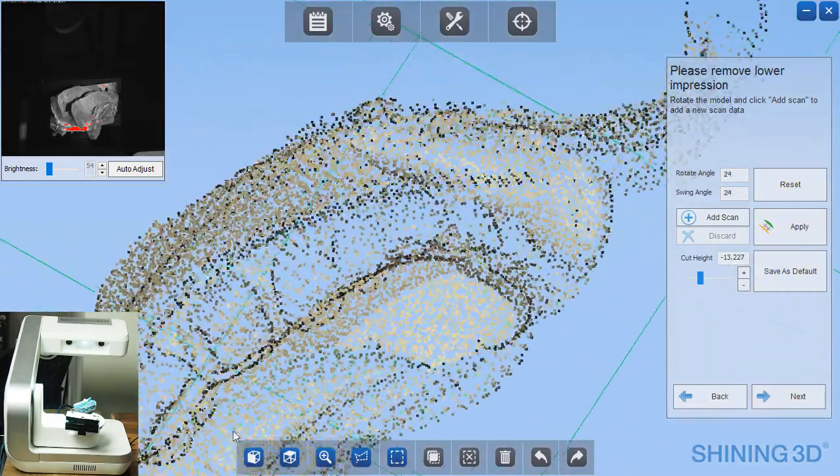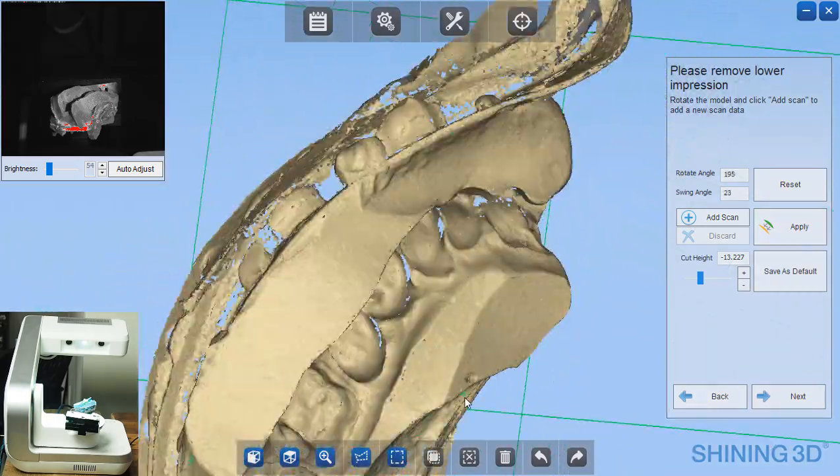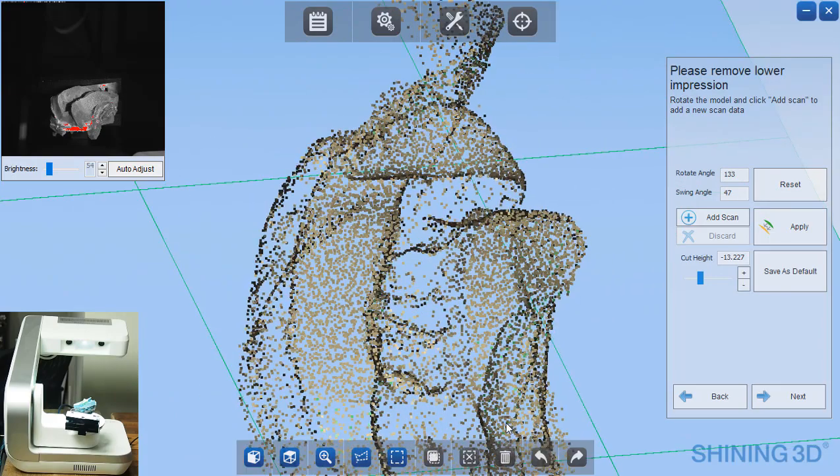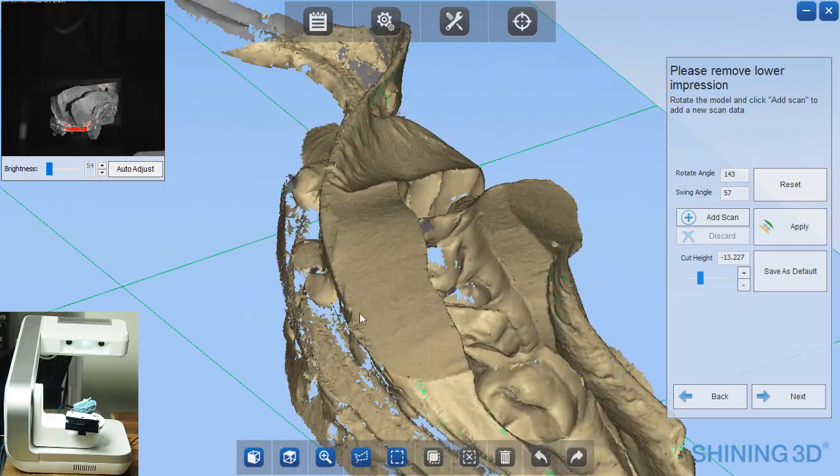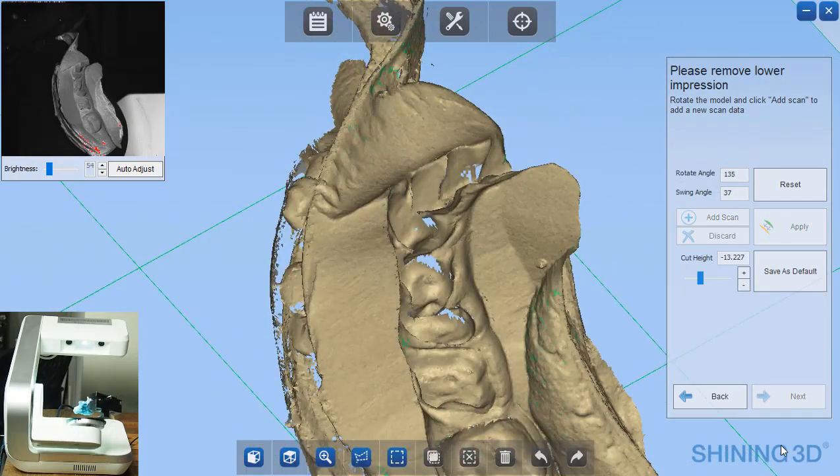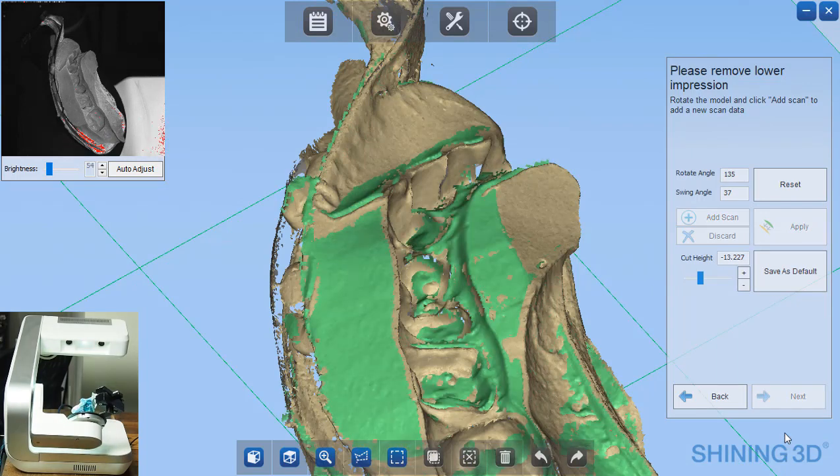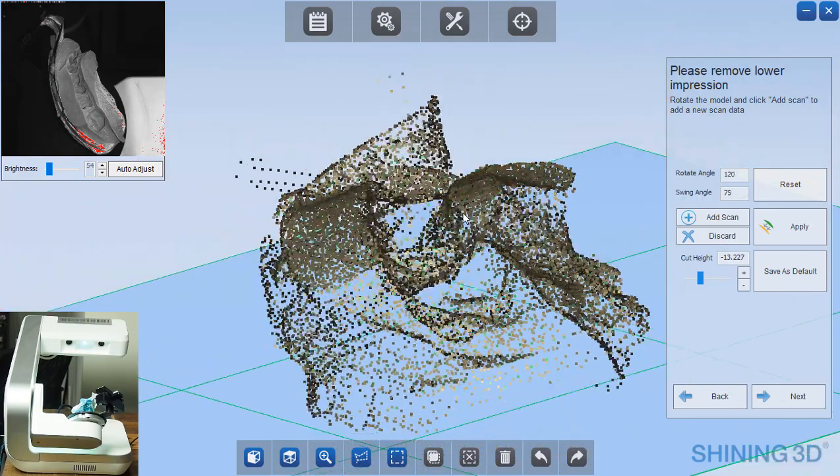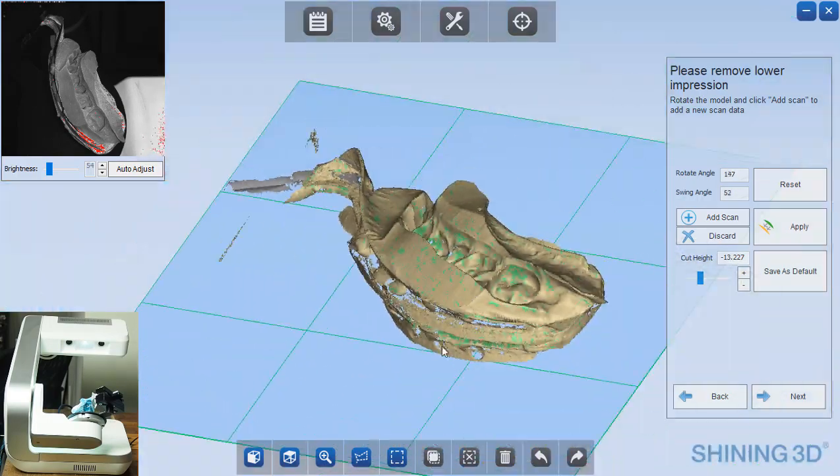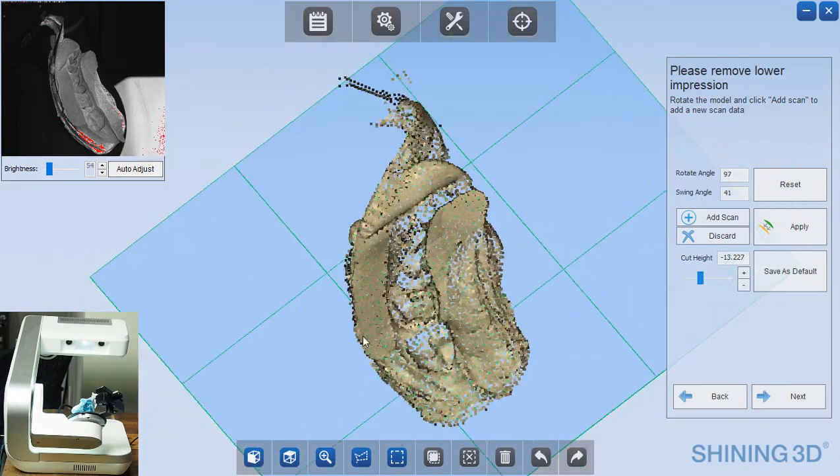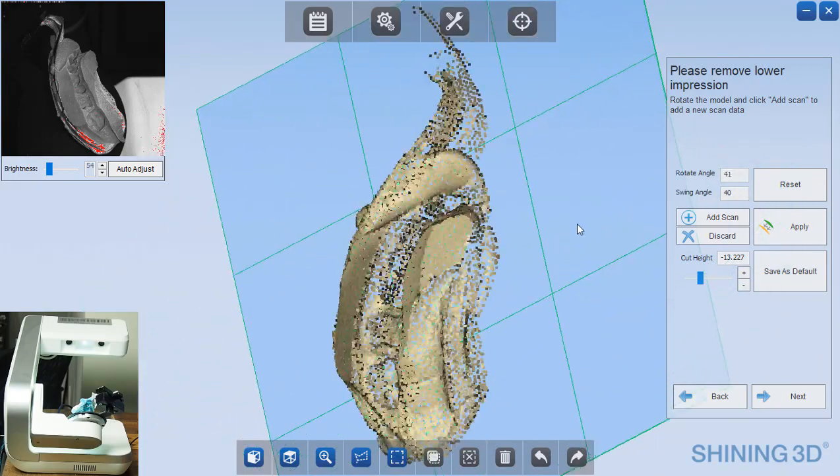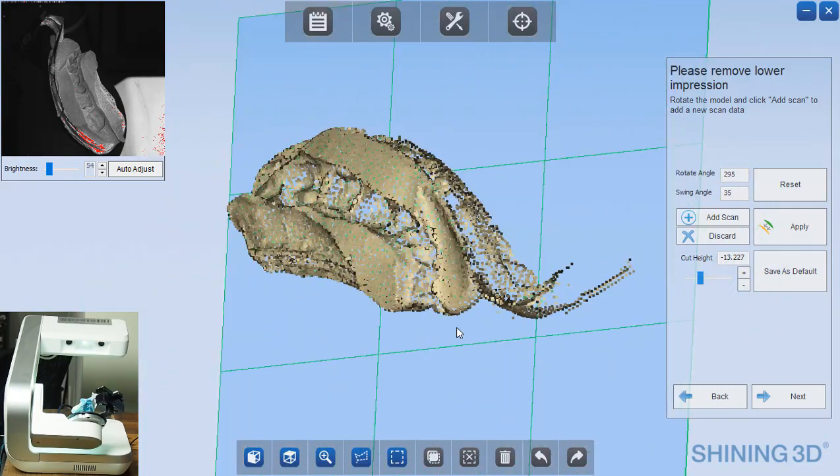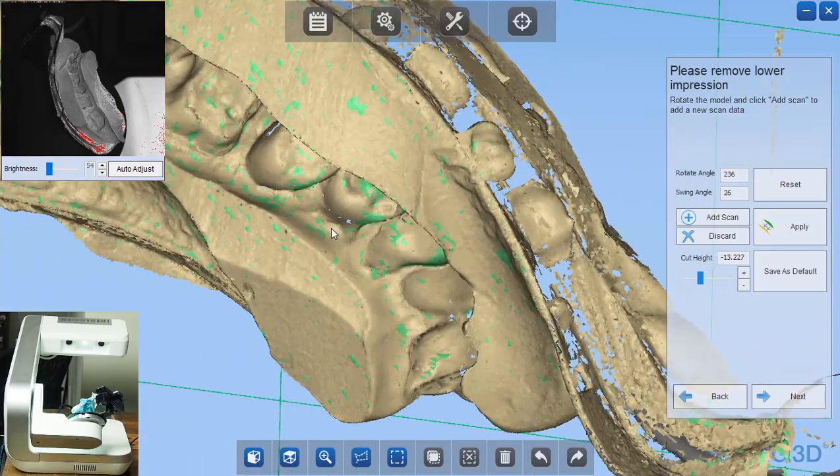And at that point, you can look at this image in more detail and look for any areas where there might be missed data. If you zoom in there, you can see that there's some holes in the mesh. If you click add scan, you can actually add some more scan data to that. It will capture another image and that will reduce the holes inside of this image. I'm going to flip this around and look at this from every angle.